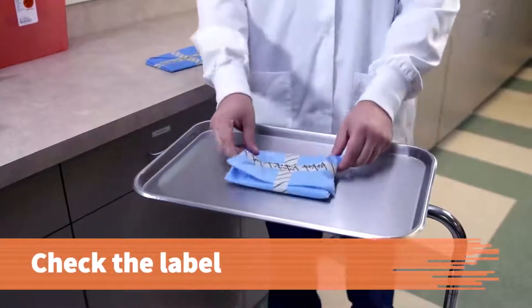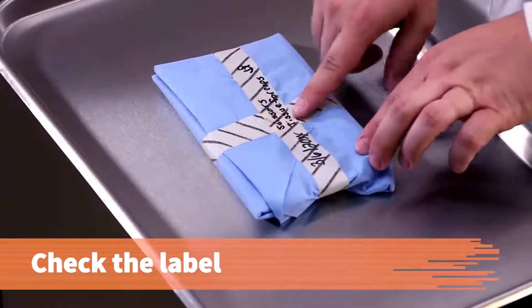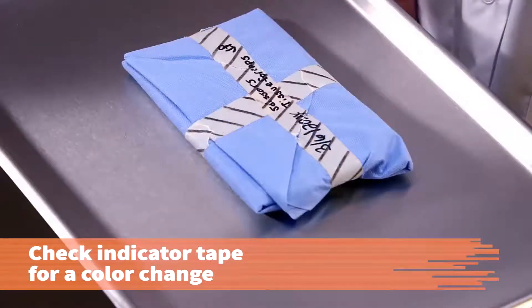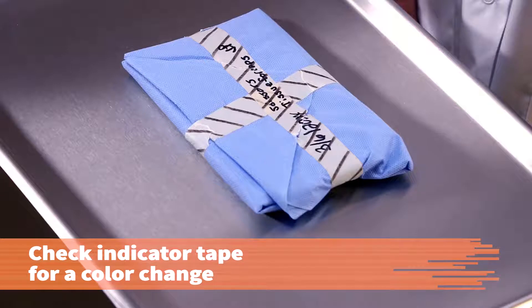Place the instrument pack on the Mayo stand or countertop and check the label again. Autoclave indicator tape changes color after the sterilization procedure, so check the indicator tape for a color change.